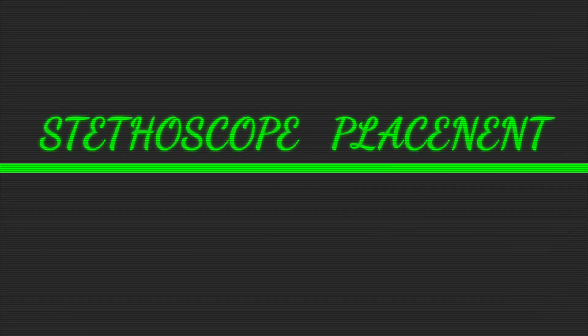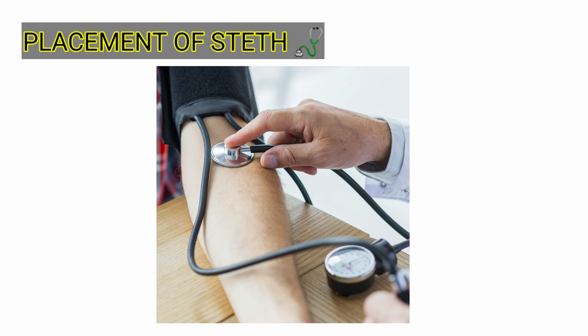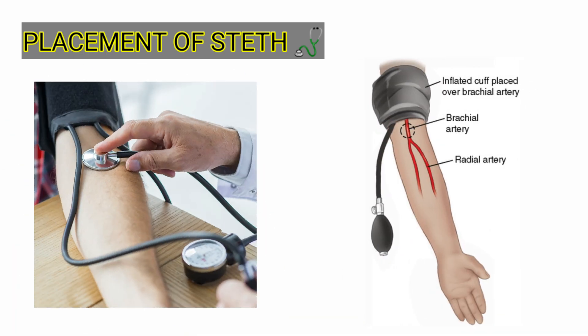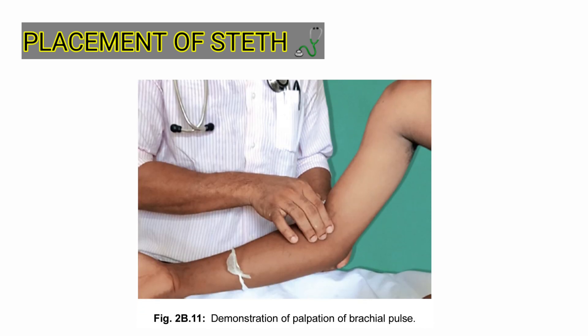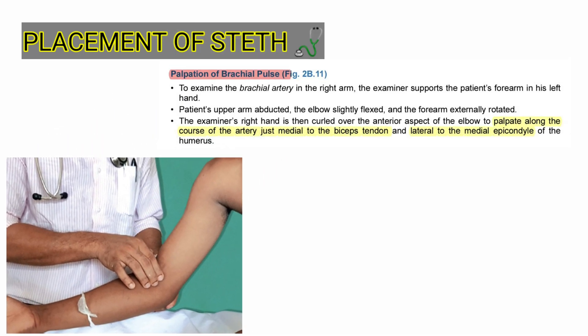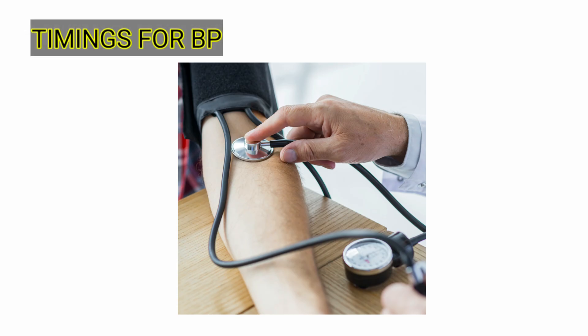Our fourth point is regarding placement of the stethoscope. A very common problem is not hearing the correct Korotkoff sound, which occurs mainly due to wrong placement of the stethoscope bell. To fix this, first palpate the brachial pulse: support the elbow, slightly abduct the arm, flex the forearm, and externally rotate it. This makes the biceps tendon prominent, and the artery can be felt just medial to this tendon. Place your stethoscope above this point.